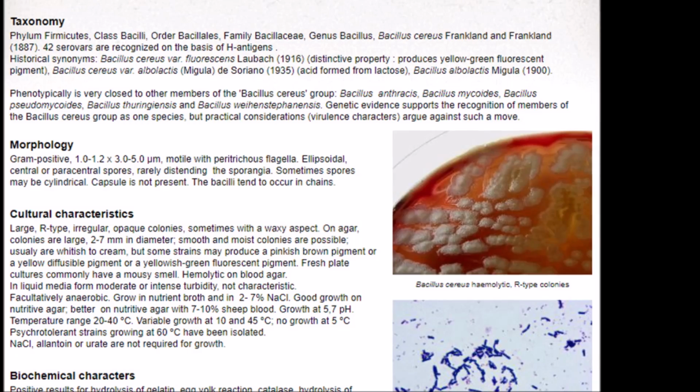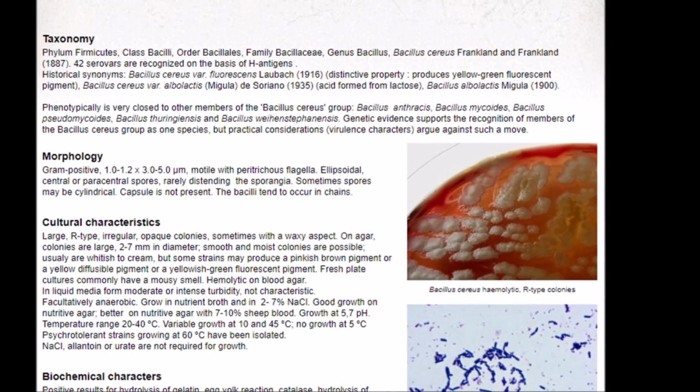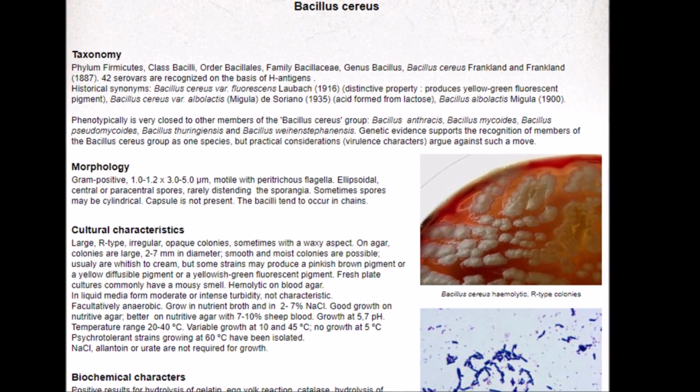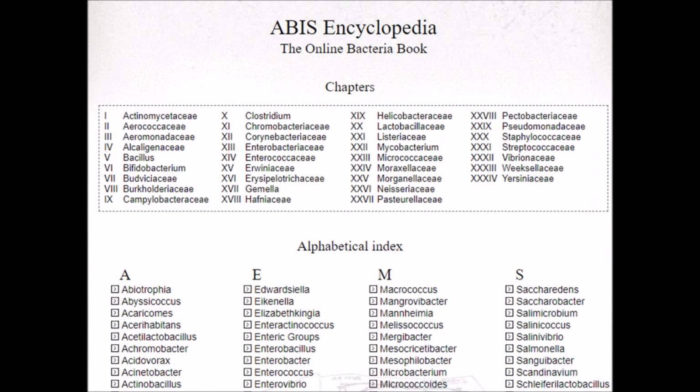But this might not be enough. Sometimes you may encounter germs with a great metabolic variability that do not fully match the identification patterns. This is why you must not entirely rely on biochemical identification. It's always recommended to check the encyclopedia before taking a final decision.